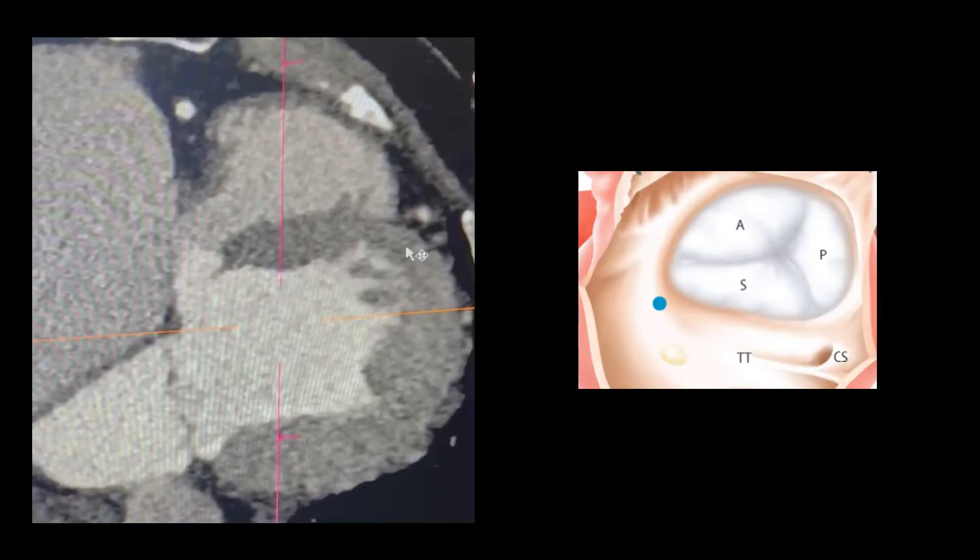Now let's see how CT scan can help in identifying the issues with the pacemaker lead. In this loop, which belongs to our patient, we can see many structures including left ventricle, right ventricle, a massively dilated right atrium, left atrium, and mitral valve.